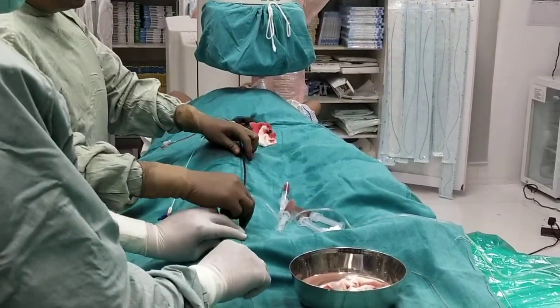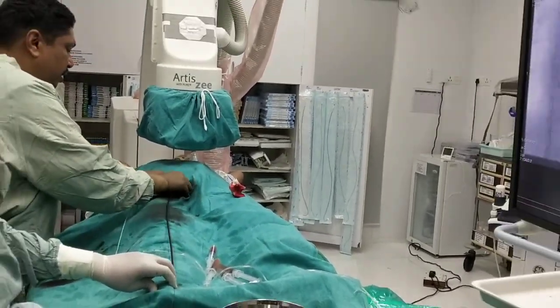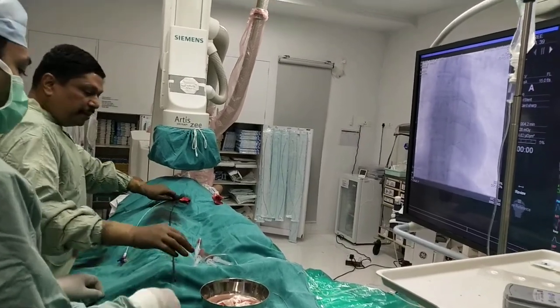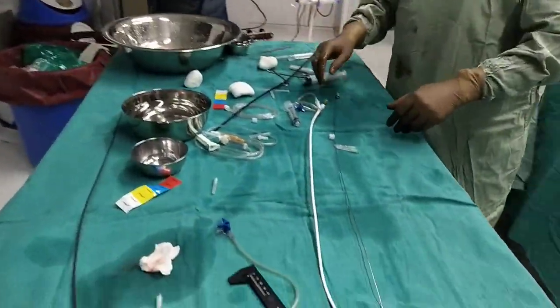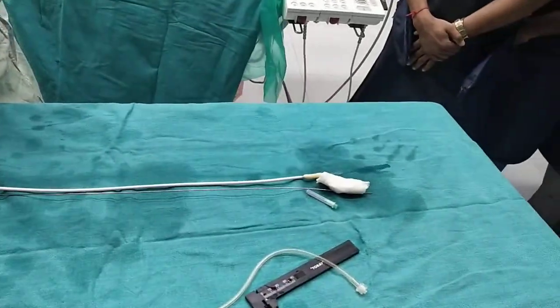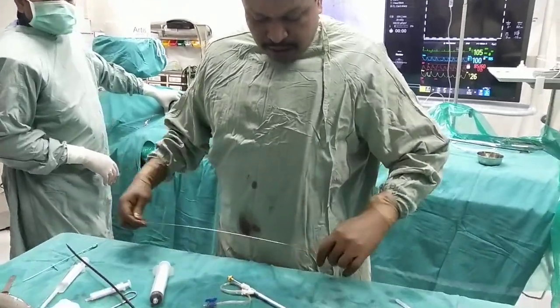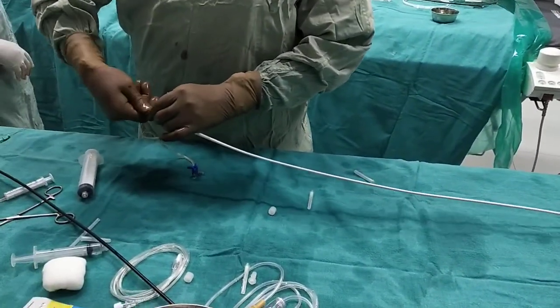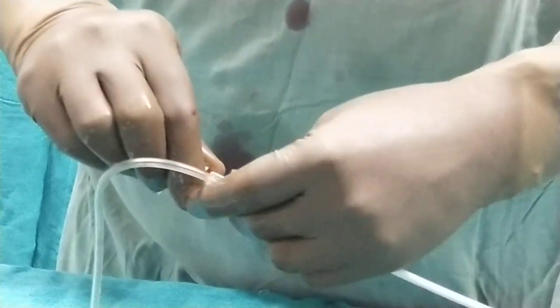This is very important because that is where your balloon gets stuck many times. We have now dilated it properly. Now we will prepare the balloon. This is an Inoue balloon which we are going to use — a modified Inoue balloon without a vent inside the balloon — and we are flushing it. We will put a silver tracker inside the main lumen, which is locked onto the gold catheter. You have to lock the silver on the gold and then only push it, and then lock it.